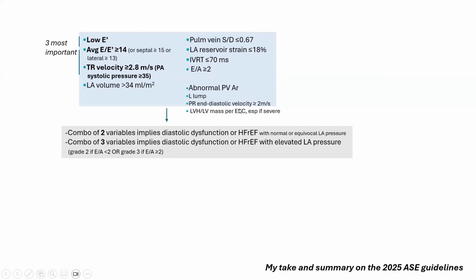And I personally like to add the LVH, severe LV mass elevation, which is used by the ESC guidelines in their HFpEF algorithm, which I think is important to incorporate along with the other parameters.